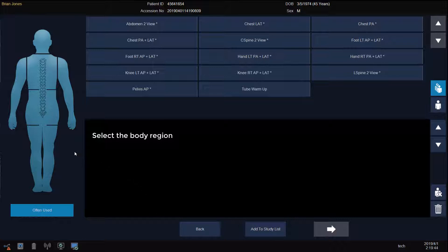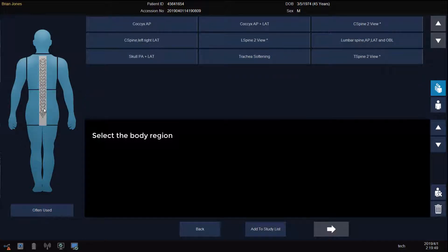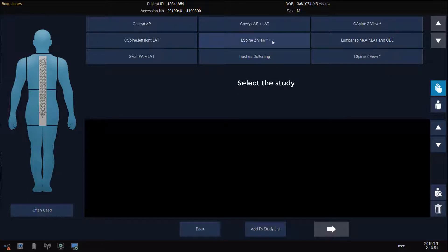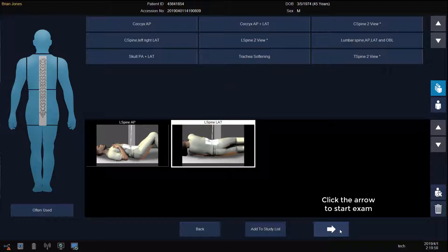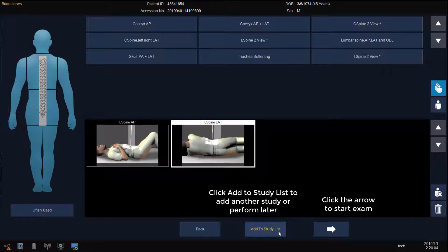Click Add Views. Select the body region for the study that you wish to perform, then click on the study you wish to perform. Now click on the arrow to start the exam, or click Add to Study List to add another study for that patient or to perform the study later.